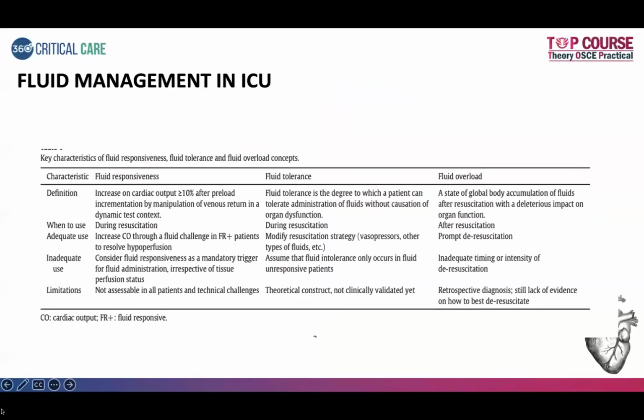So coming to the major definitions, what is fluid responsiveness? Whenever you give a fluid challenge to the patient, you see an increase in the cardiac output of more than or equal to 10% after a preload incrementation by manipulation of venous return in a dynamic test context. So basically, when you give a preload challenge, you see an increase in the cardiac output of more than or equal to 10%. That word is very important. You see the change in the cardiac output, not by BP, not by urine output, but you have to have real-time cardiac output monitoring.